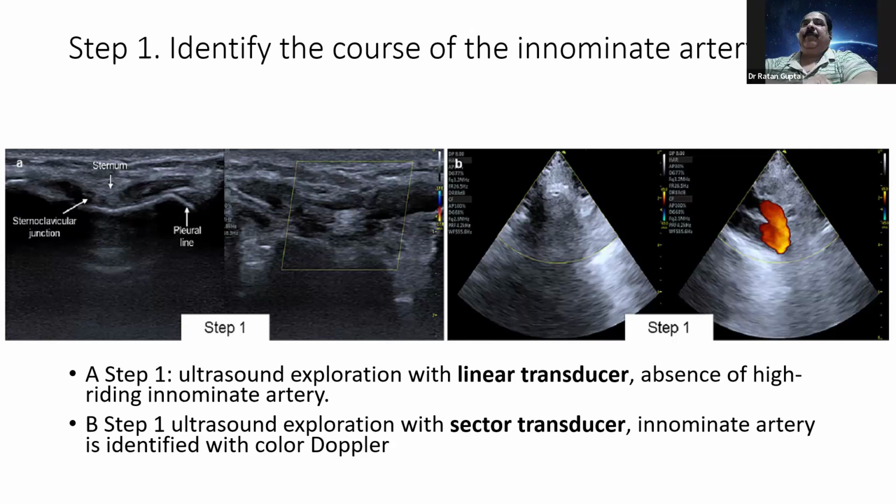Yeah, I think whenever I try, I feel the air and loss of resistance very easily. And another important step is the air; we always check that air is coming into the syringe filled with the saline. One more important thing I wanted to tell, I just forgot. All the images, apart from the article images, whatever videos, they're all acquired by me at the bedside. So we practice real-time ultrasound, and it's quite helpful, sir.